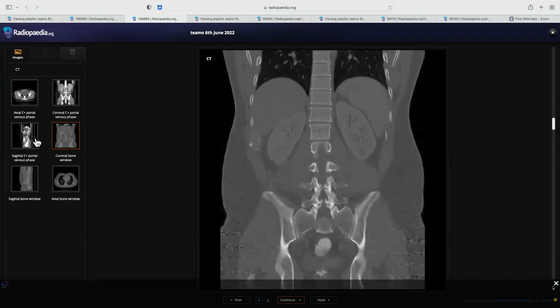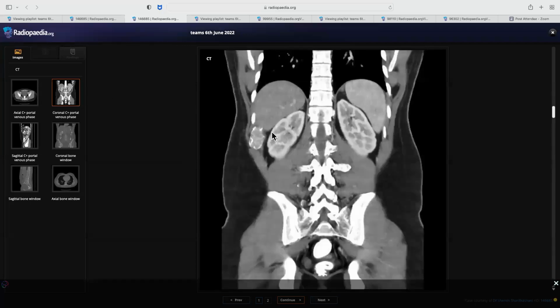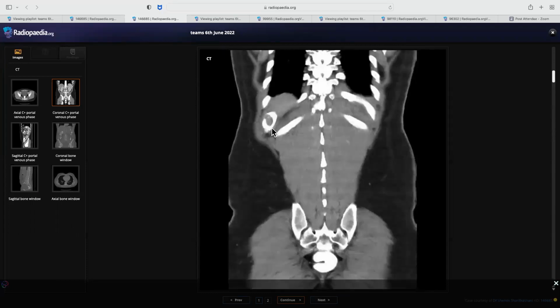So you can see, you immediately said ground glass when I gave that hint to you, when I asked, is it destructive? Then after saying ground glass, you very nicely told about Shepherd's crook and associations, and everything about fibrous dysplasia. I think that was your first case. So we're done with your cases. So very well done, Dr.